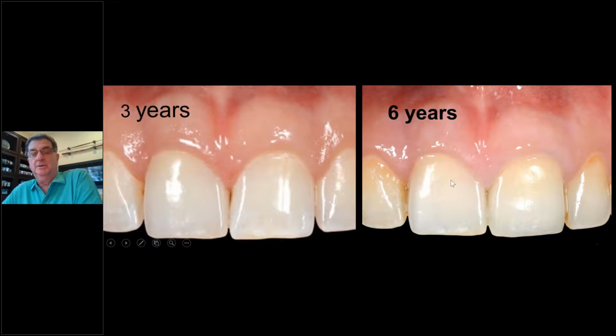Maybe the tissue went up a hair, but nothing that is visible to the patient, and we're really doing pretty fine. Something which is not the topic for today, I want you to look at something. Let me go back for a second. That's the day of placement. Here's the day, 3 years later.